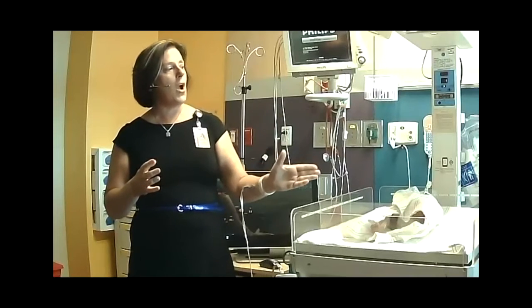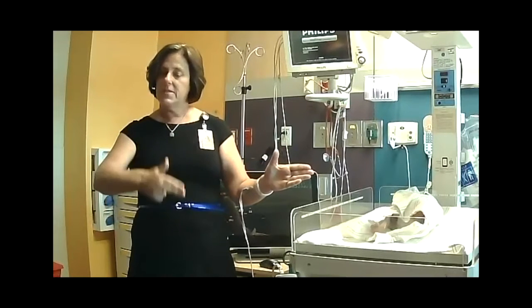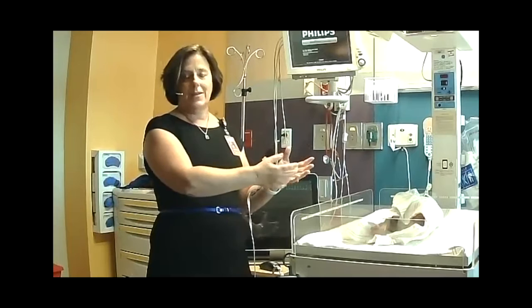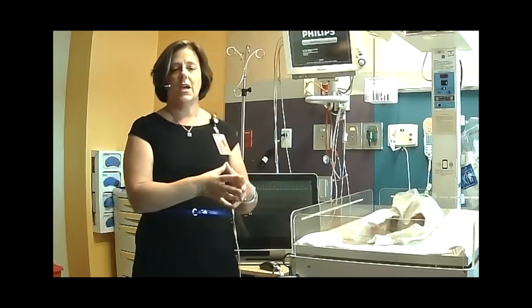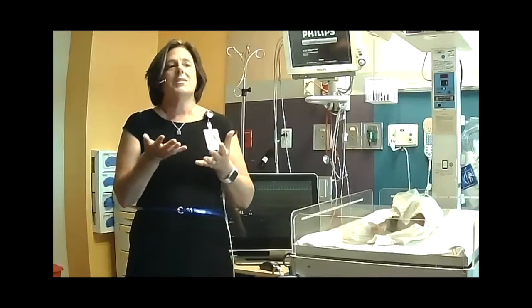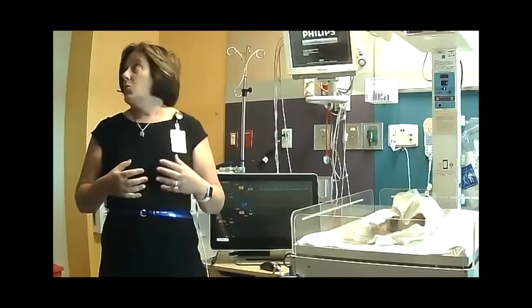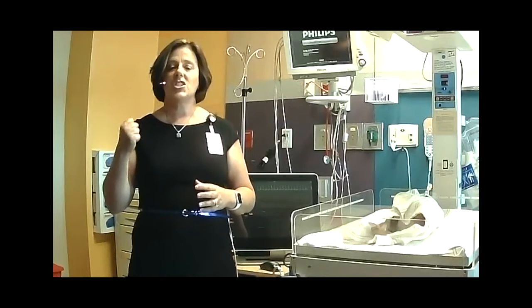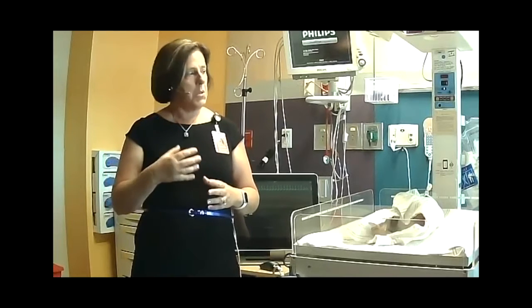So when you see NIRS drop, it's going to go up, down, up, down, up, down. We're looking at trends. Okay, where is it? How is it doing? How are we doing on the consistent? When I stop working out, or I stop eating, or I stop assessing your baby, right? Changing their diaper, or doing all these invasive things, I stop, does that number come back up and say, oh, getting enough flow now, we're not stressed, we're good. So that's what we'll watch with NIRS, is where are we? So what it should be is when the blood goes out, 75% should come back oxygenated. That's good. I consider that an A work, okay? Can you get a B? B might be in the 60s, 60%.